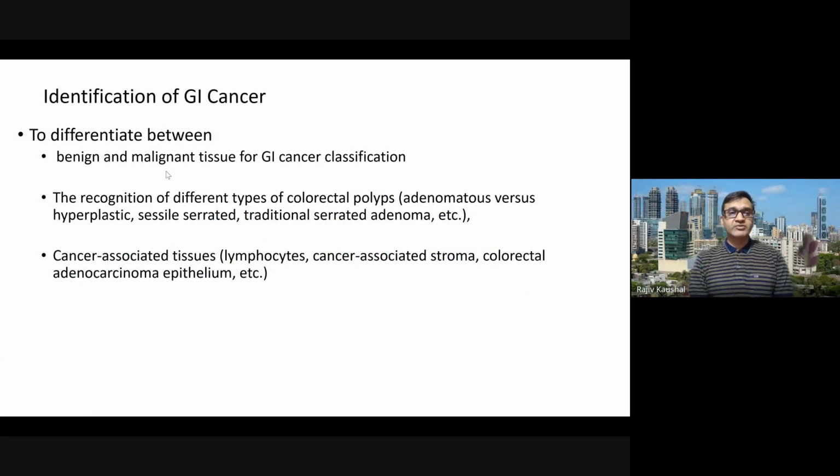So how do they work? They work on a very simple principle, because computer science works on binary numbers like 0 and 1. So for them there are usually no gray zones. That's why these AI models have still not become generalized to date, because they believe that they can easily distinguish benign versus malignant.